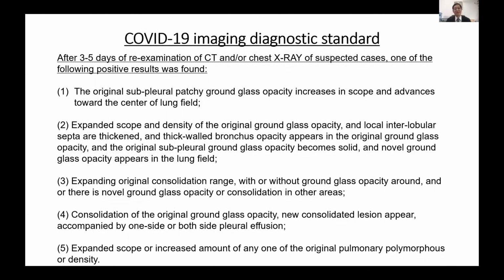COVID-19 image diagnostic standard. After 3-5 days of re-examination of CT and chest X-ray of suspected cases, one of the following positive results was found.